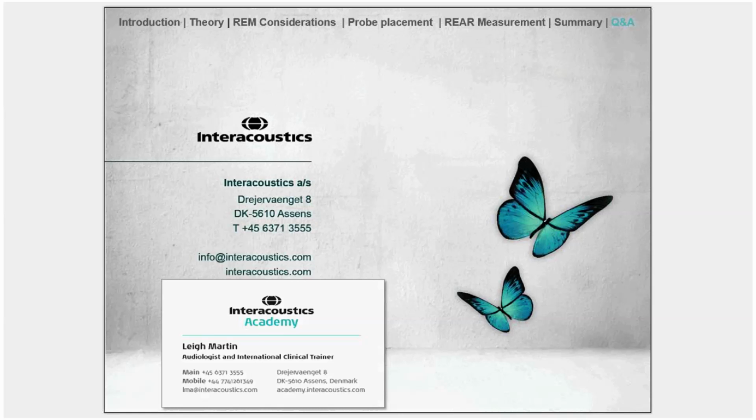So an option then you could do would be to try and use a more open hearing aid dome, such as an open dome rather than a closed dome, for instance. That's the way which I would use these measurements to assess how occluding the ear mold is.